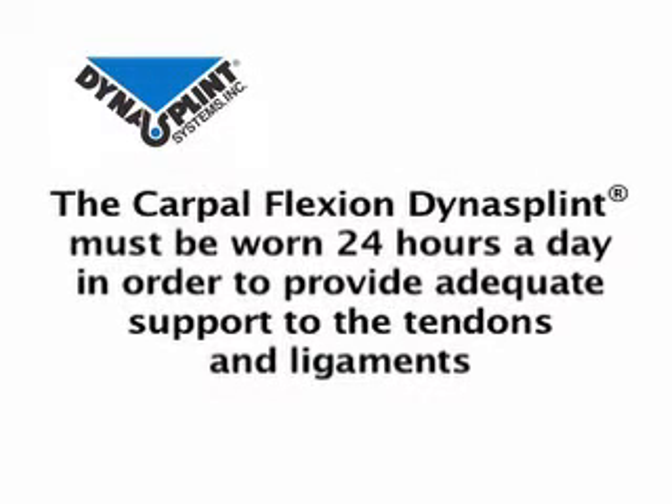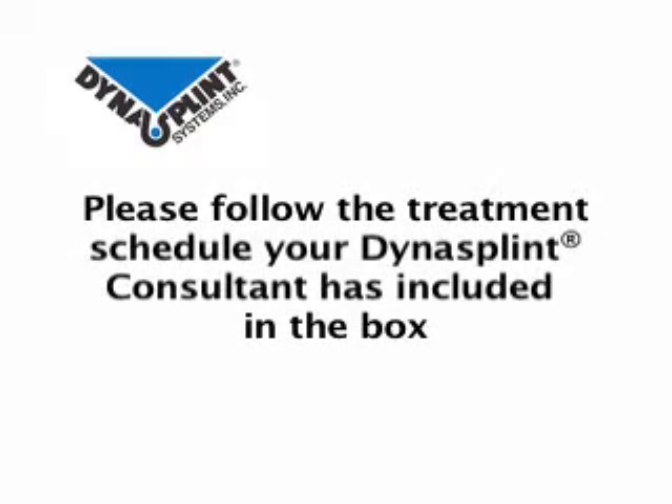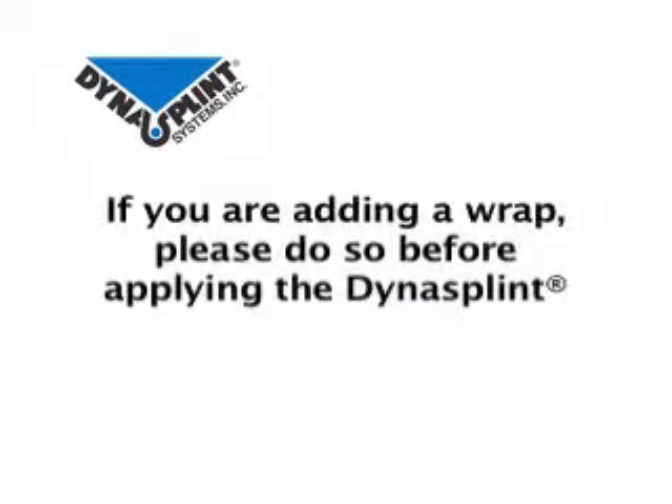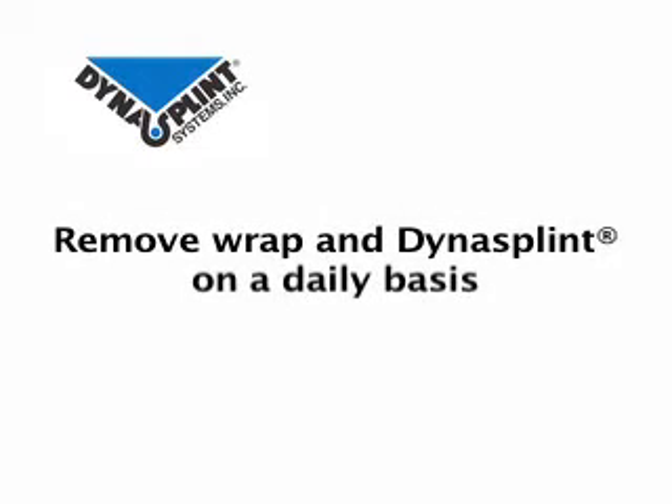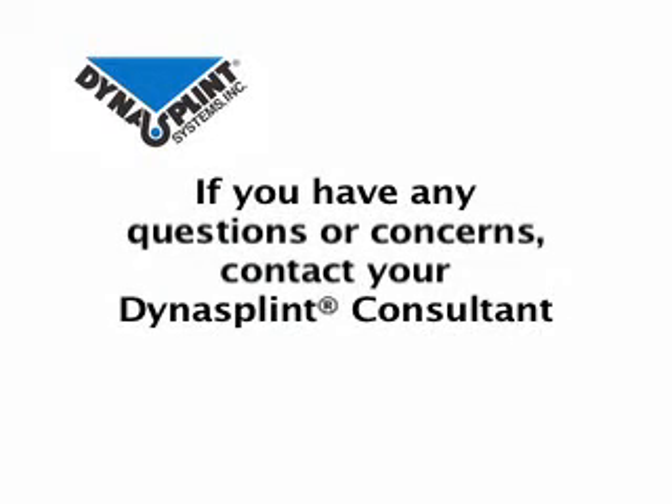The carpal flexion Dynasplint must be worn 24 hours a day in order to provide adequate support to the tendons and ligaments. The horse must be stalled when wearing the Dynasplint system. Please follow the treatment schedule your Dynasplint consultant has included in the box. If your consultant has recommended adding a wrap under the splint, please do so before splinting, and remove this wrap along with the splint on a daily basis. It is very important that you check the leg on a daily basis by running your hand up and down the leg feeling for signs of irritation or swelling. If there are any signs of soreness or stiffness that persist longer than 15 to 20 minutes, please contact your Dynasplint consultant.